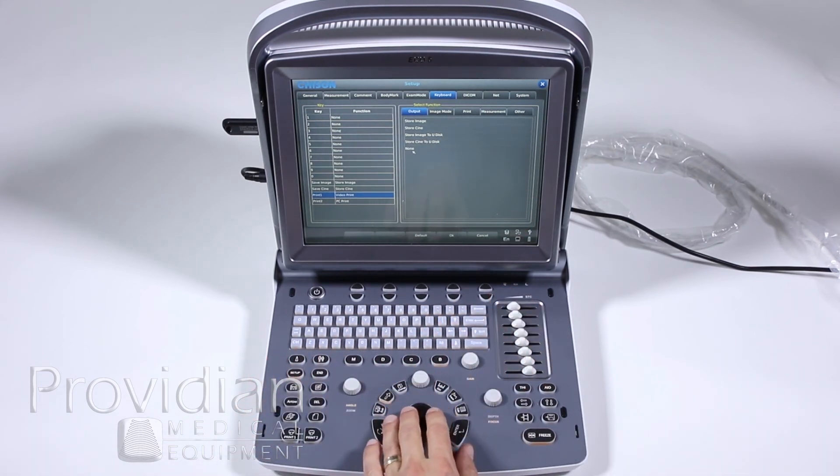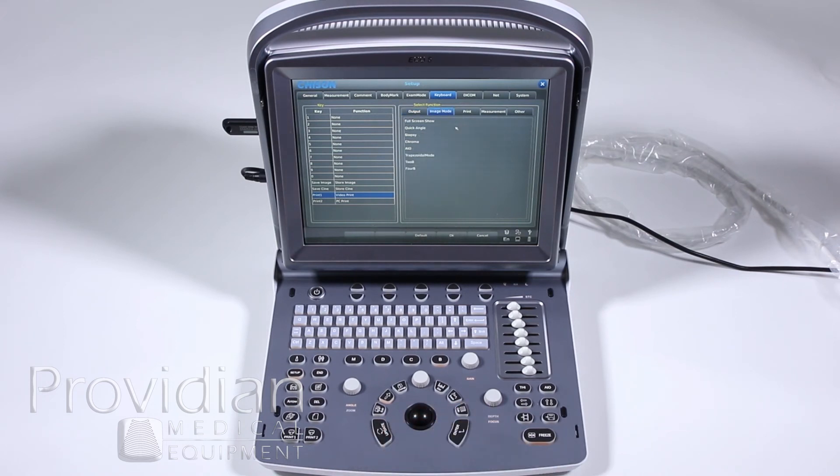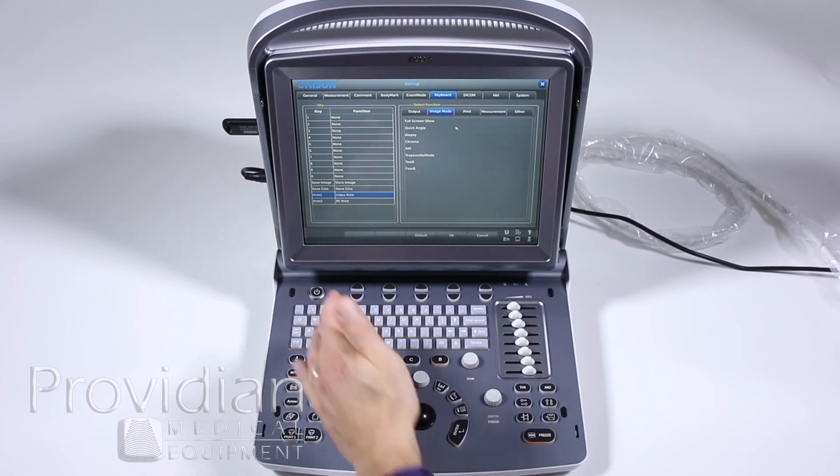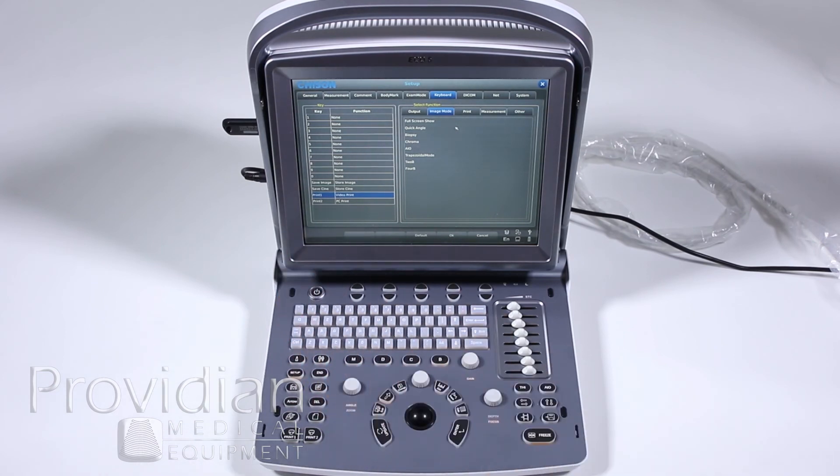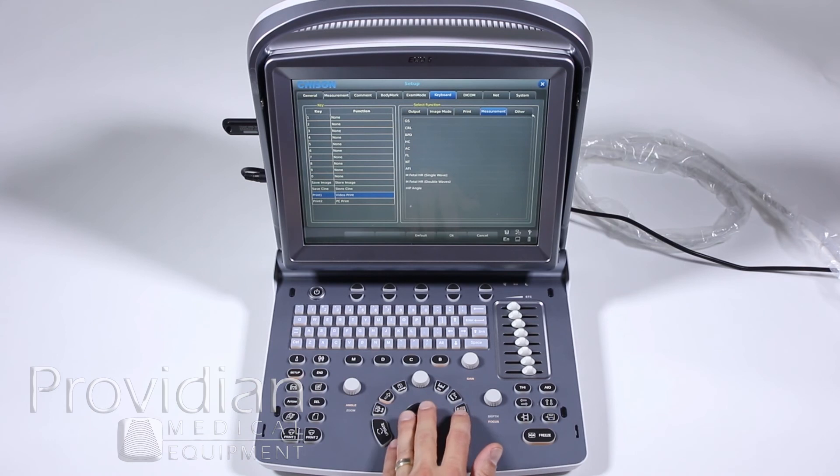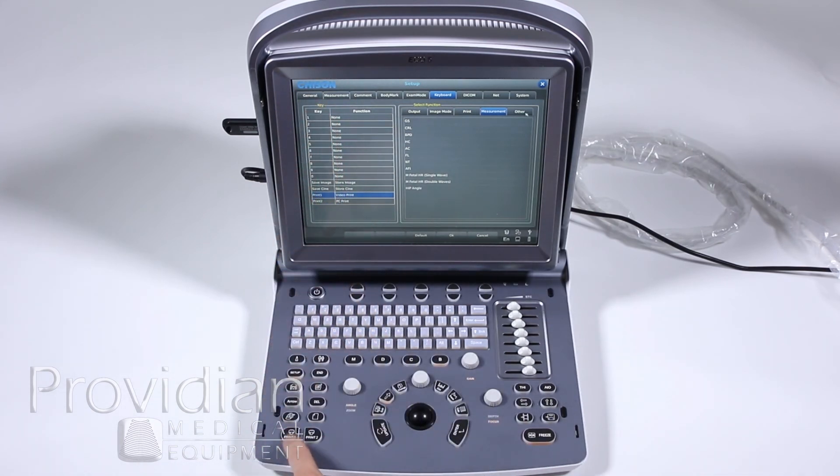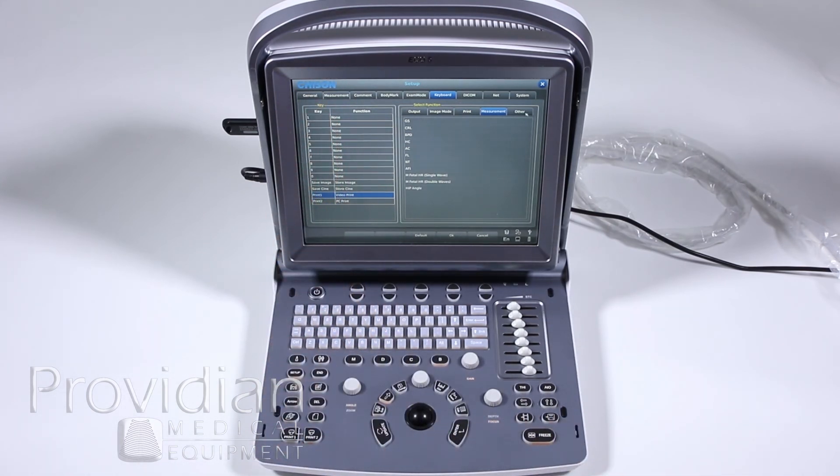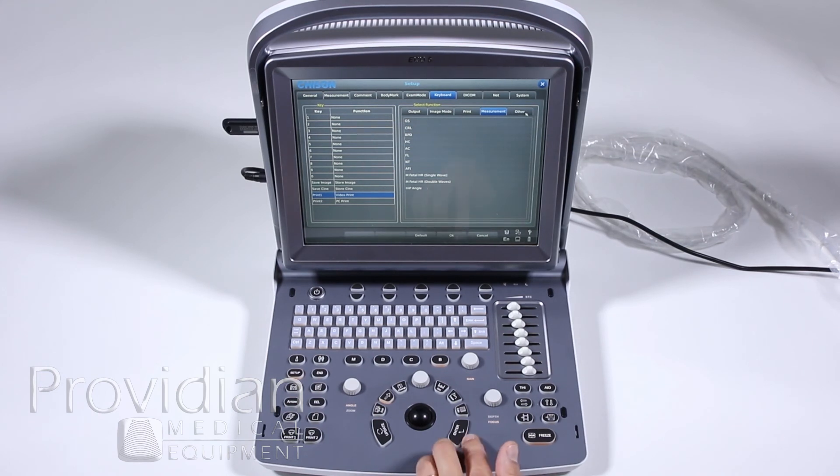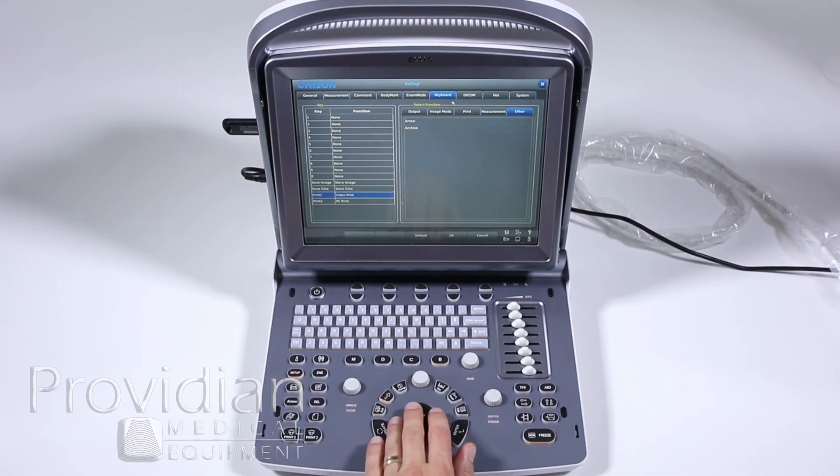Also shows you, you can go to a full screen by hitting one of these keys if you want to press one. So again, you have all these options here on assigning to keys one through zero or any of these print one, print two, the Cine loop and the save can all be customized to whatever it is that you would like if you just want the arrow or the archive to show up.